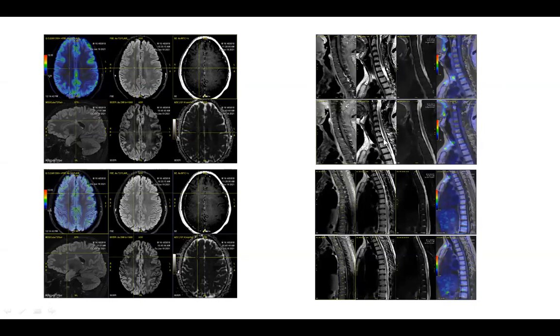Now, the idea here is that this is a patient as a whole. We are not only pathologically minded with a cancer, searching only for metastasis. The importance of this whole body survey is that it can give us answers to certain symptomatology that is not explained by metastatic or neoplastic involvement.